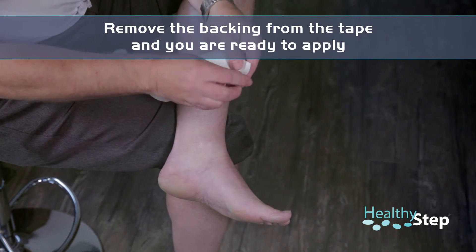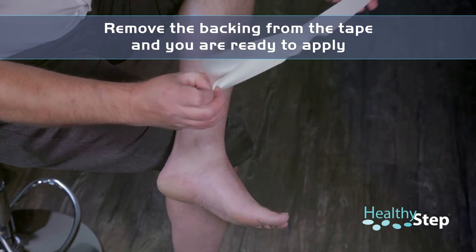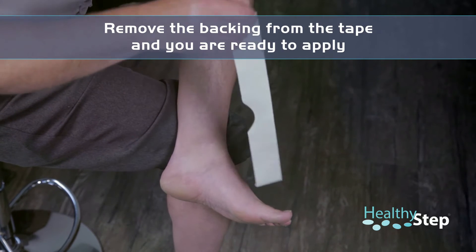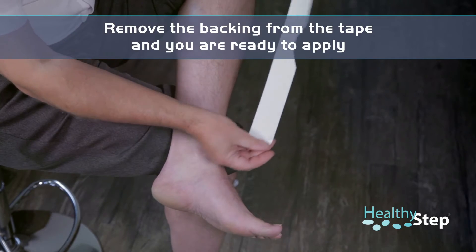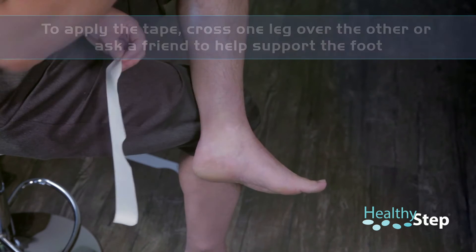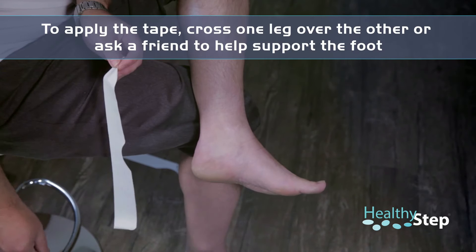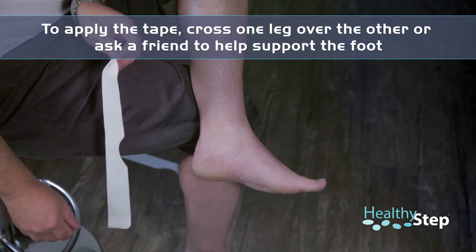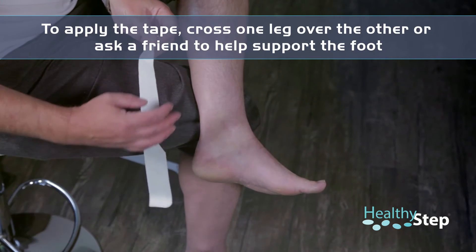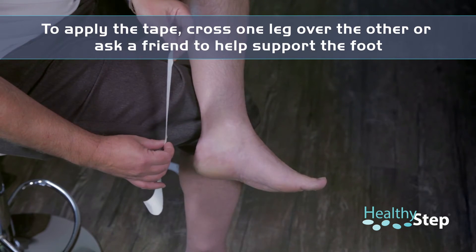Before you apply the tape, remove the backing and your tape is ready to be applied. There are a number of ways of applying the tape. One of the easiest ways is if you can cross one leg over the other. This will act as a great support, but you may need to support the foot on a chair or have a family member or friend apply this for you if you find it difficult.